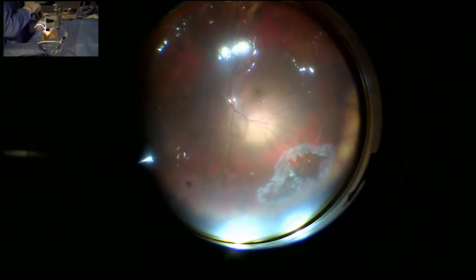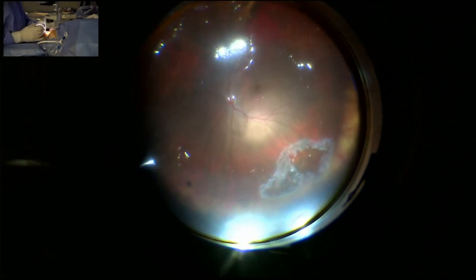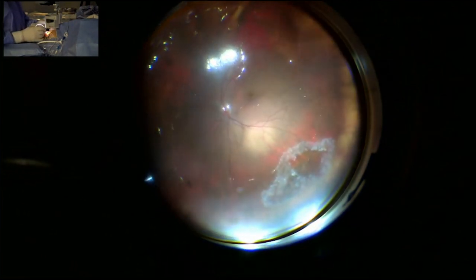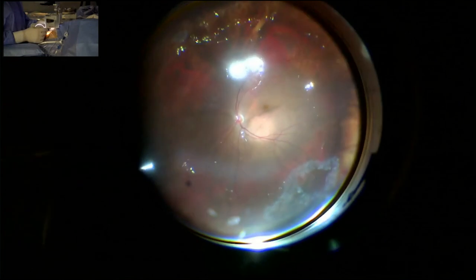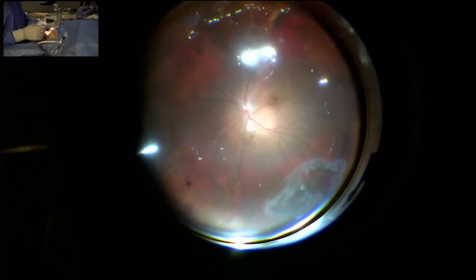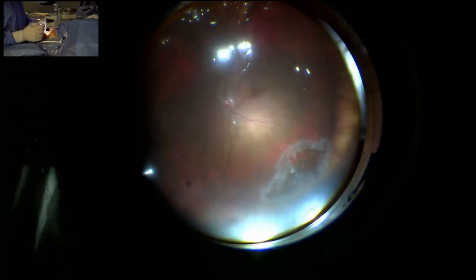Professor, we see a picture. So this is the final position. I would like to show you the final position of the eye. You can see the retina is completely attached. The tear is lasered, and you can see the indentation, and all the periphery is completely attached. There is no air, and this is the other laser area, and this is the nasal part. And we will give gas now and finish the surgery.